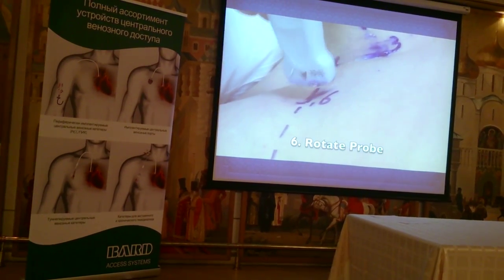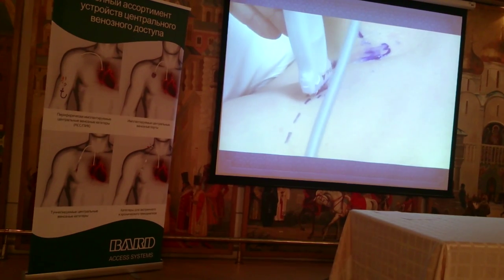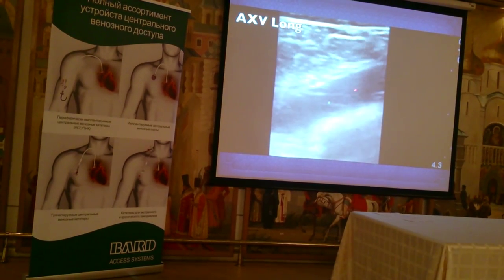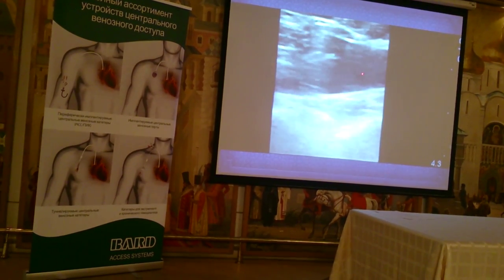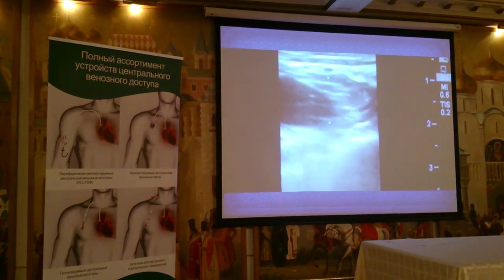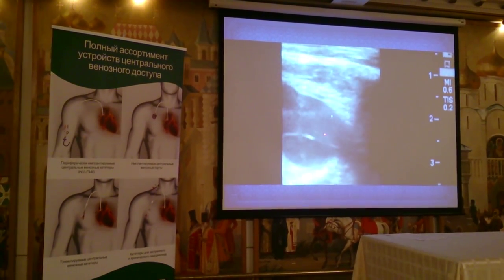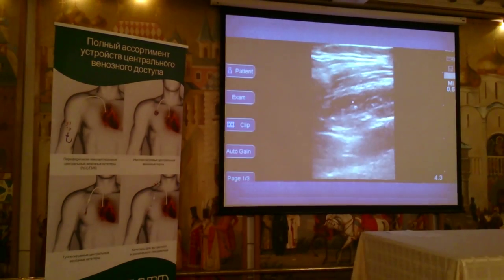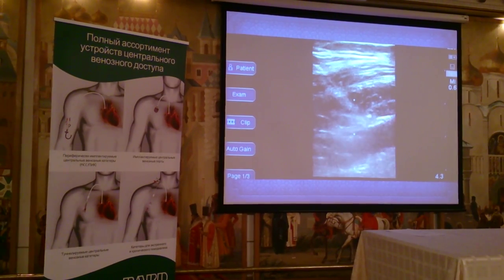Position number six: we take the probe in the deltopectoral groove and turn it 90 degrees, so now we're parallel to the course of the vein. Here we can see the axillary vein in longitudinal section. We follow it until we know we're getting close to the subclavian valve — and we can see the valve at the base of the subclavian vein. You can then see the needle coming through the tissue toward the longitudinal axillary vein. This is a very useful technique.